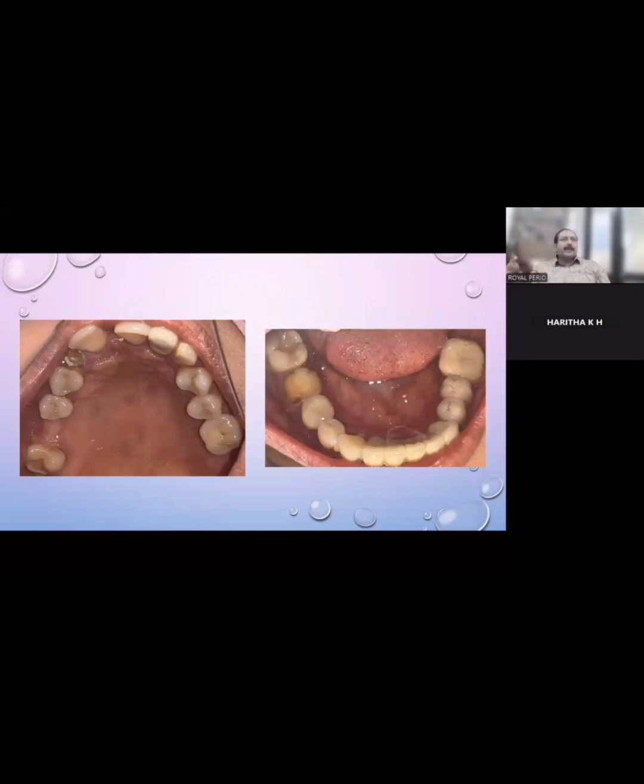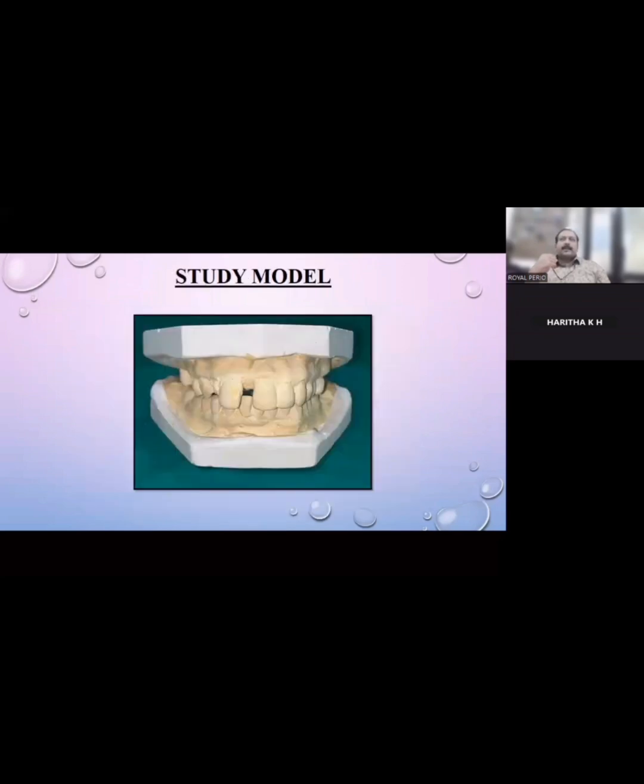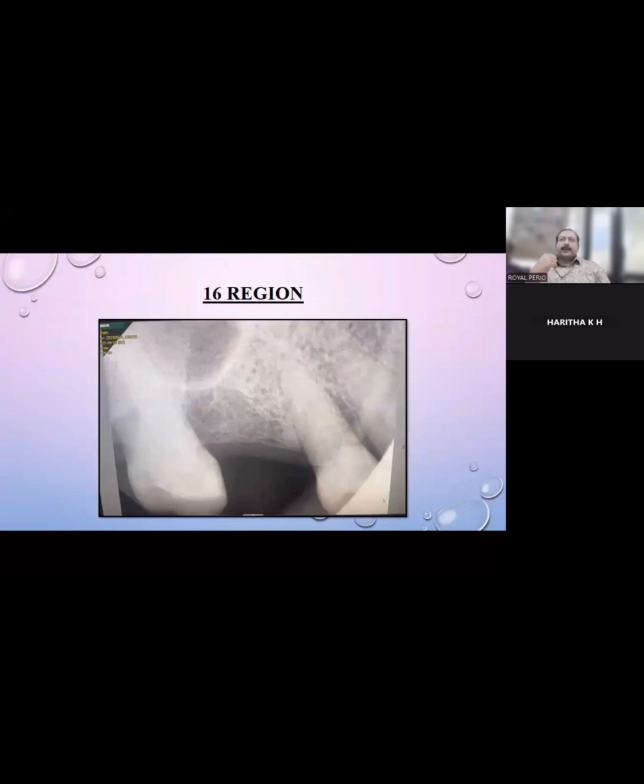So lateral, 1 immediate implant. What about the molar? Yeah, 1.6. That one thing we need to study. So in between another 2 implants. So let's start planning with that 1.6 first. Let's see the condition of 1.6 in bone, in the radiograph. Seems to be not having enough bone height. How is it otherwise in other conditions? IOPA. Yeah, this is the IOPA, right?